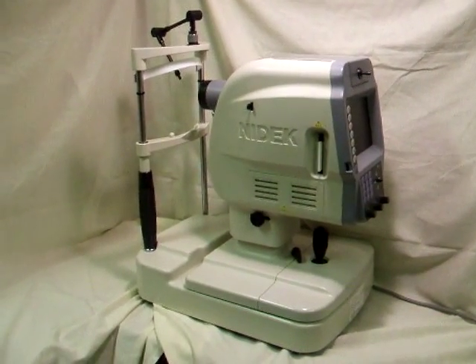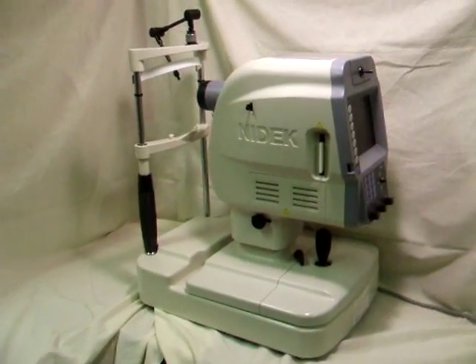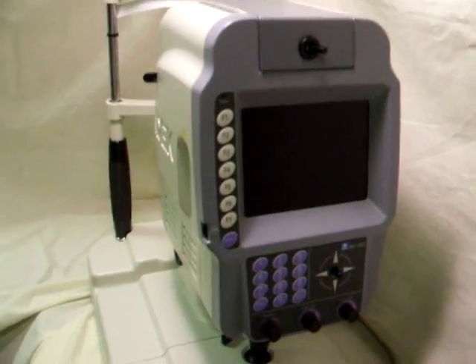Hello. For sale here is a very nice NIDIC non-Mydriatic fundus camera, model NM1000. It works perfectly and is in excellent cosmetic condition.